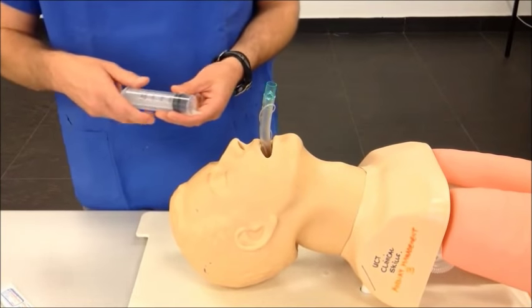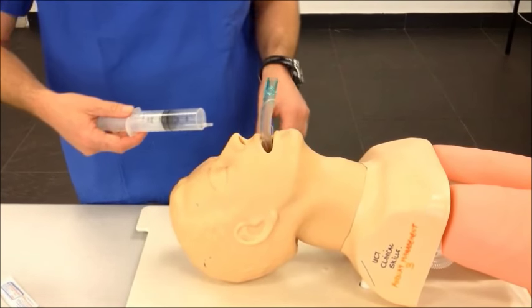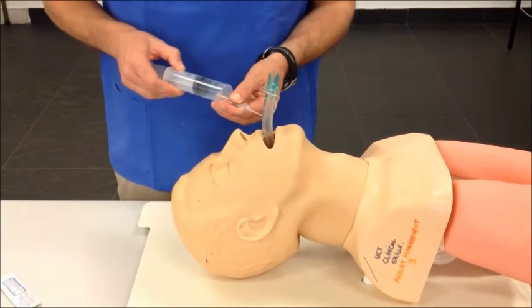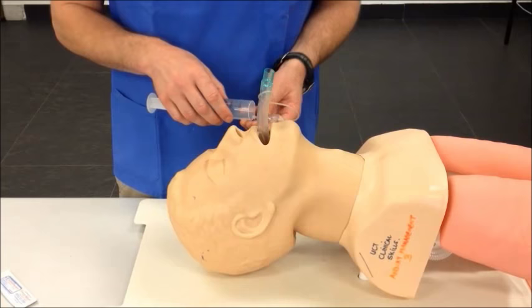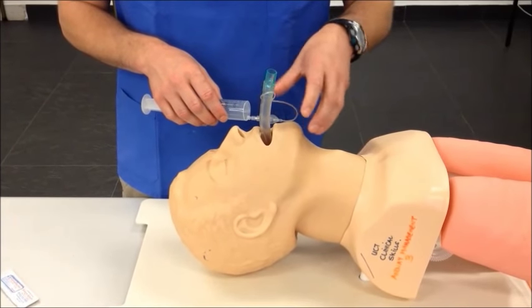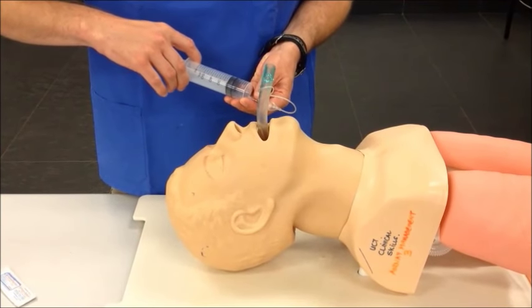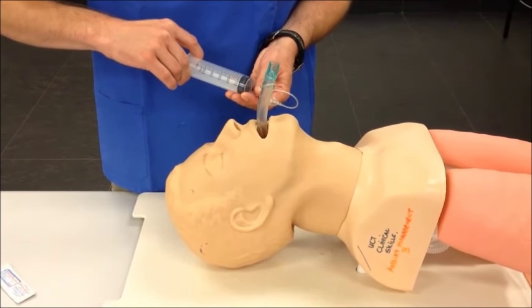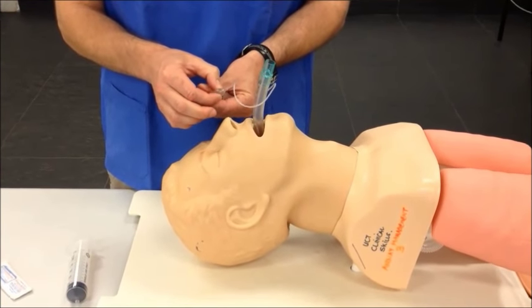At this point, select the amount of air — 30 ml as indicated upon the tube — and inflate the LMA cuff. It's important not to touch the tube itself so that the LMA cuff can seat itself anatomically without interference from outside forces. As we inflate it, we can see the tube seating, and we confirm good pressure in the pilot cuff bulb.